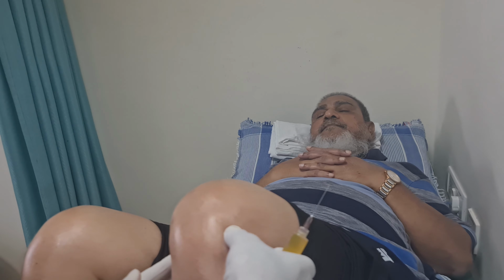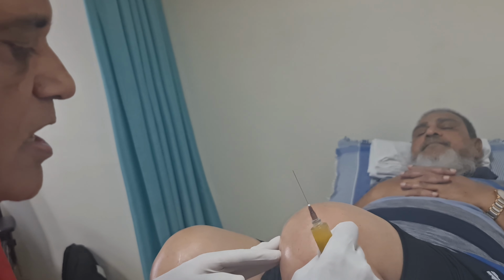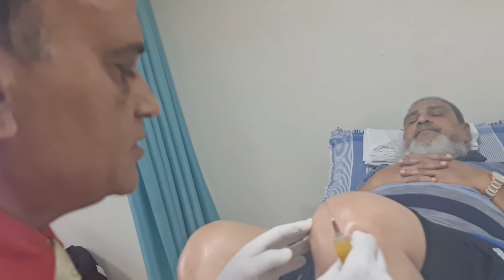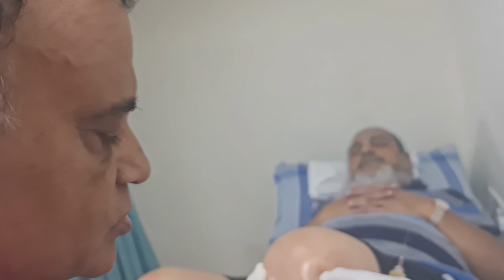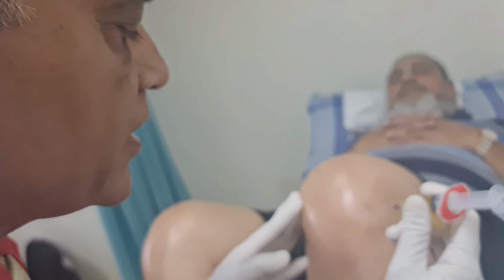This is the joint line, and this is the hard bony surface of the thigh bone, the femur. And just a finger's breadth outside the patellar tendon is a soft spot here. Place your thumb, it goes in, as you can see. That's the place where I've already infiltrated with local anesthetic.